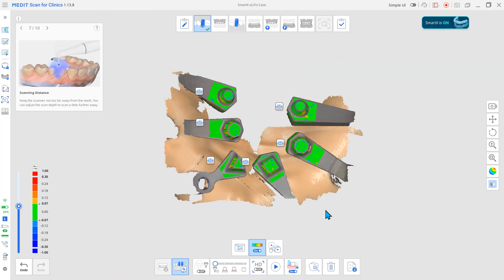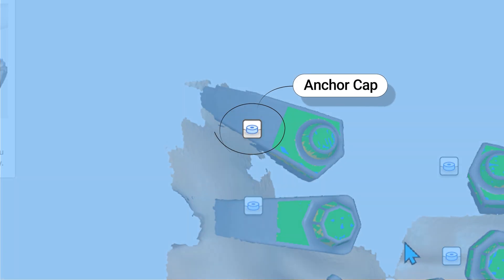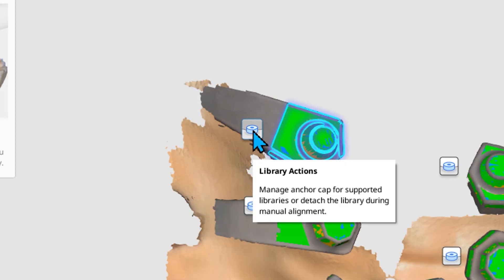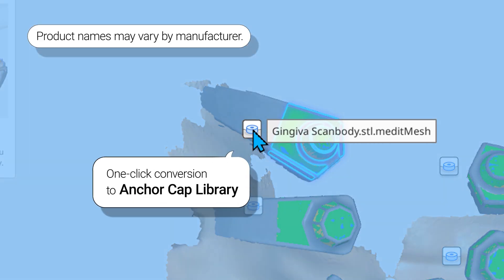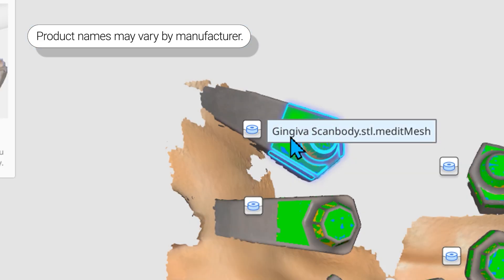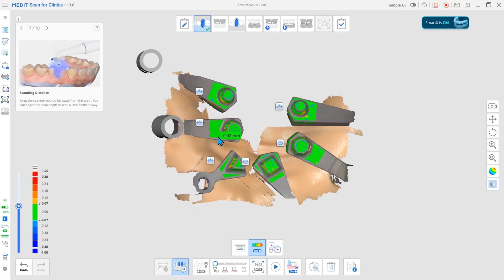After scan body alignment, click the button to add an anchor cap library. The anchor cap is a standardized digital cap generated from the implant position after scan body alignment, serving as a reference point for both implant positioning and soft tissue scanning.